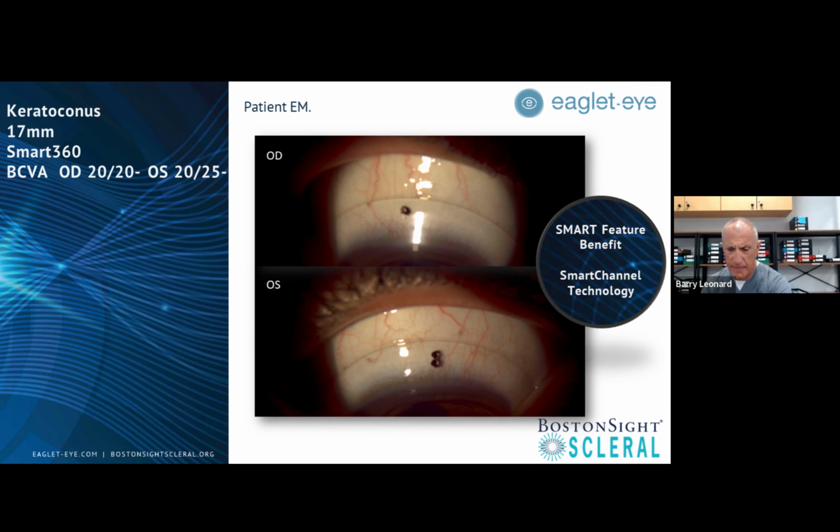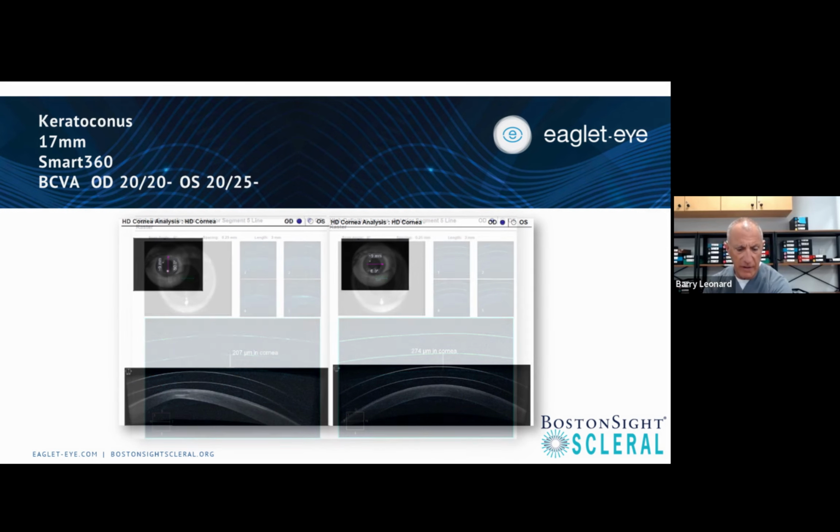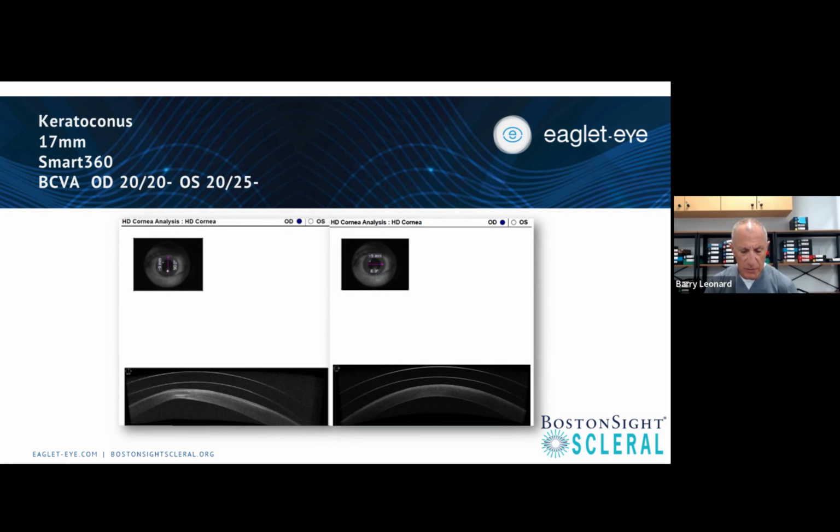So let's move on. We can see some of the scans. There's the right eye and the left eye. These are a horizontal scan, pretty nice and even, good. I like to fit closer around 200 microns, getting where we were. In this case, we just made some very small changes to the original lens design. We put the, like I say, the front toricity and the channels in there, and not a lot of other things had to be done.